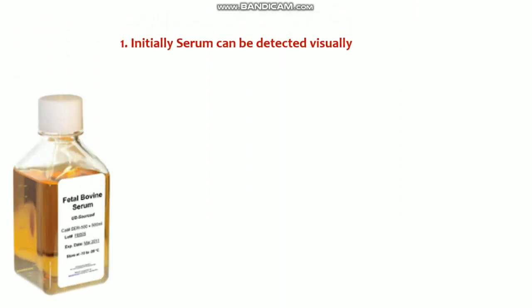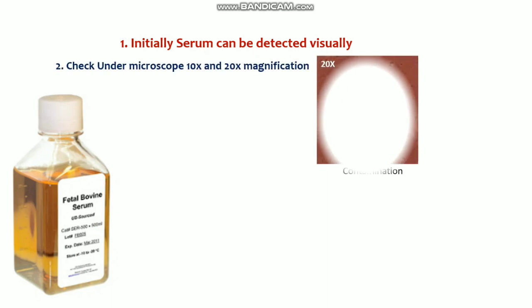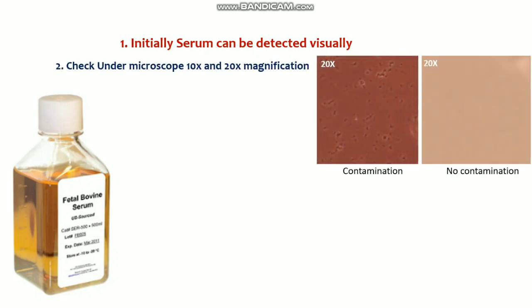Next is how to detect contamination in the serum. Initially also you can detect visually. If it is clear, then obviously there is nothing inside. But to confirm, you need to make sure, because in some cases you cannot detect it, since some serum is itself cloudy. In that case you need to check under the microscope at 10x or 20x magnification. As you see here, I did this for my serum, and I found this kind of contamination. Here you can see in 20x magnification this kind of noisy background. This noisy background is the contaminant. So there is something inside the serum, and you need to discard this serum.